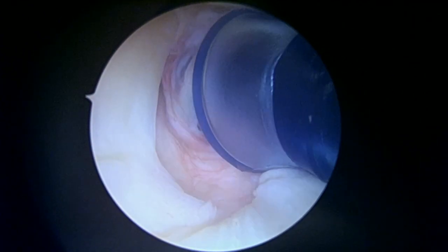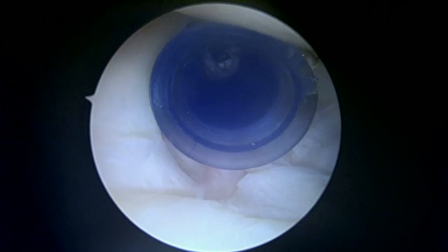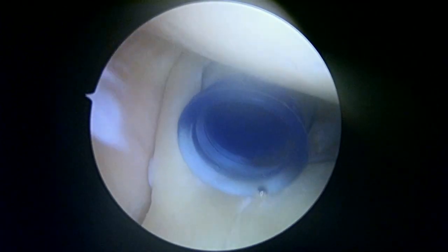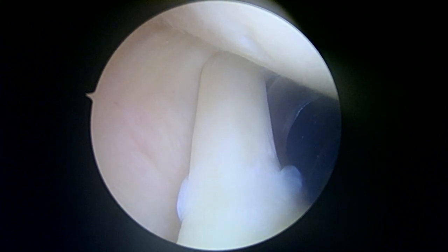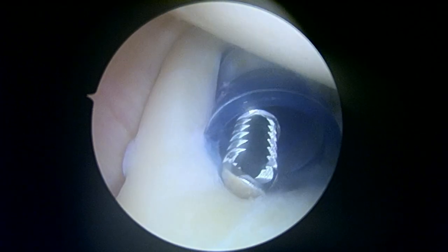All right Keith, we're just getting started. This is the look with you laying on your side. The camera's coming in the back of your shoulder. That blue cannula you see is coming in the front. To the left of the blue cannula is the biceps tendon — the long head of the biceps tendon. Down below is the biceps anchor, and you can see a little split in it. I'm going to put a shaver there to make sure it's not unstable.